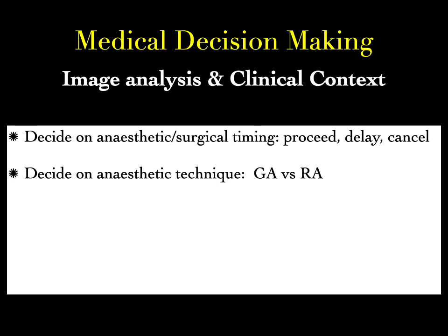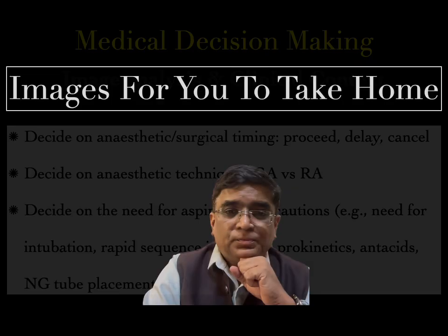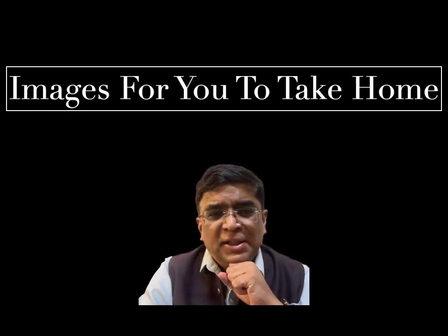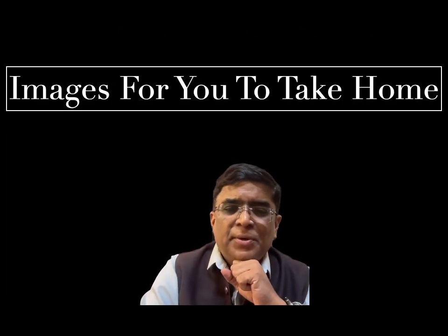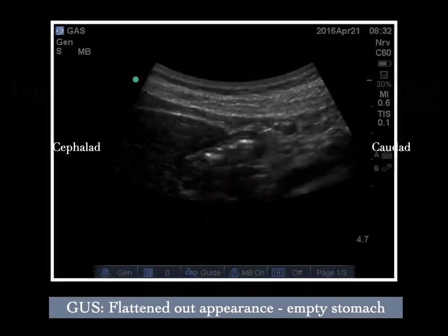In case there are some stomach contents, you may want to decide to wait before you proceed. If you want to proceed, you have choices of giving regional anesthesia or general anesthesia. If you want to proceed with general anesthesia still, then you can take adequate precautions to ensure that the aspiration chances are minimal. Okay. Before I complete, these are some very good images for you to take home, review in your own time, and understand how the stomach looks.